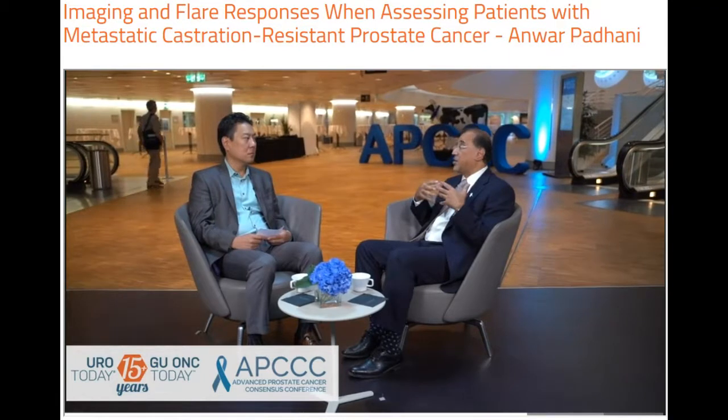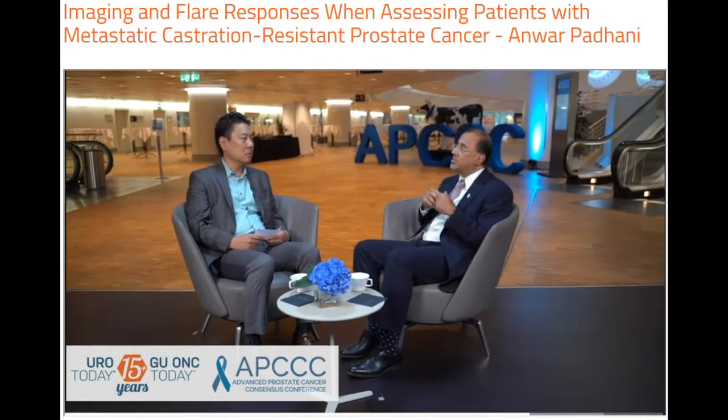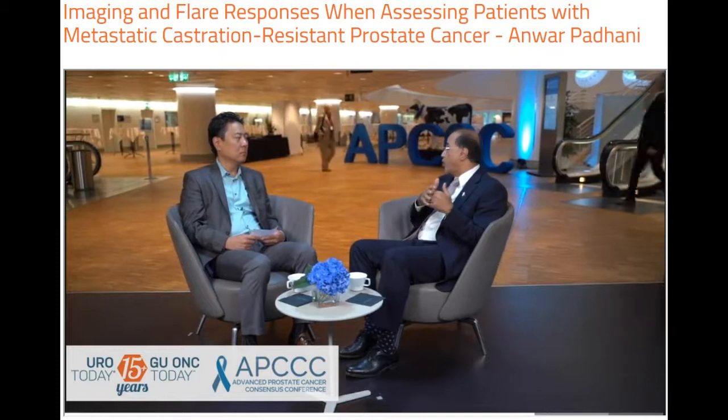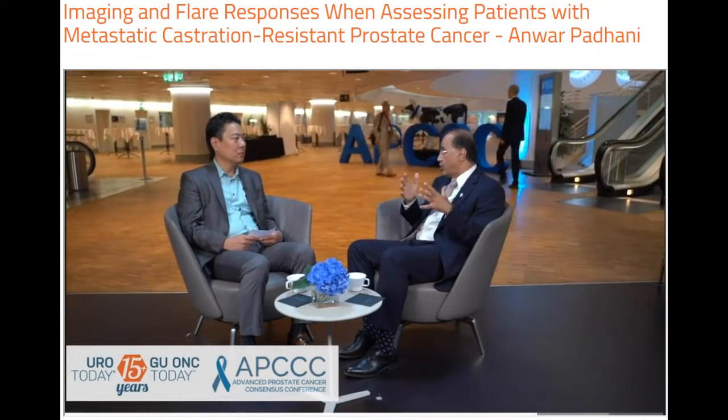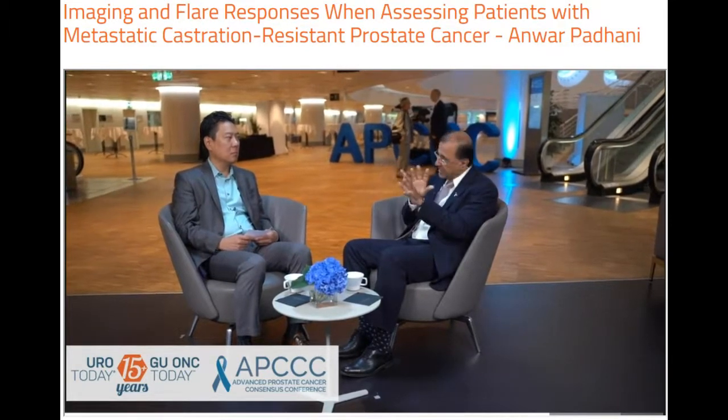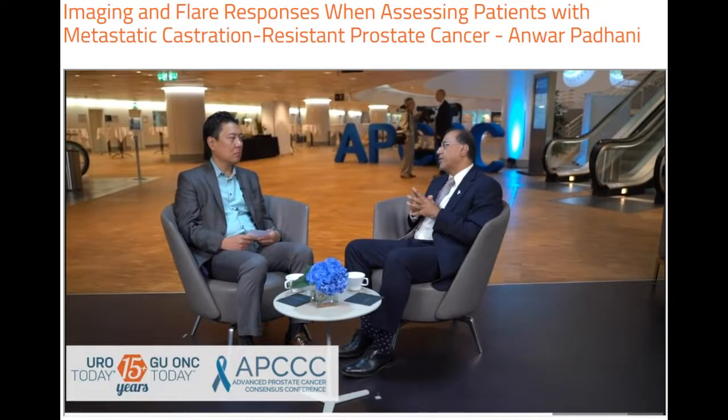In my center, I can only get 4 doses every 2 weeks. So if I've got patients on clinical trials or patients being treated, I need a technology that I can use on a daily basis that I can just do whenever I need to. So we prefer to do whole body MRI for that purpose. So there are different roles for PET technologies and for MRI.